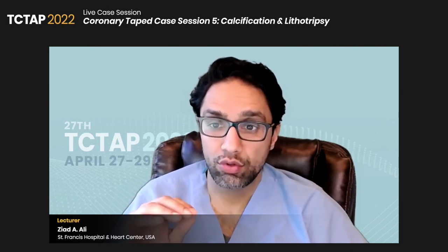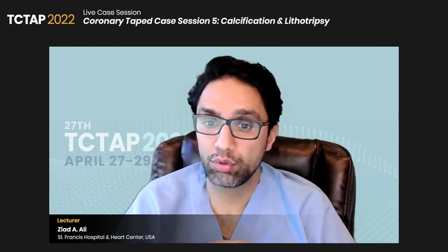But what we've now done in our practical approach to calcification is, if we see the eruptive calcific nodule, our first approach now is to use a balloon. If we use a balloon and we see complete expansion, we're confident that the nodule will get pushed into the plaque and we'll just go ahead with an NC balloon and then stent. But if we see that the balloon remains dented, then we'll use lithotripsy to fracture the calcium underneath it before placing our stent.